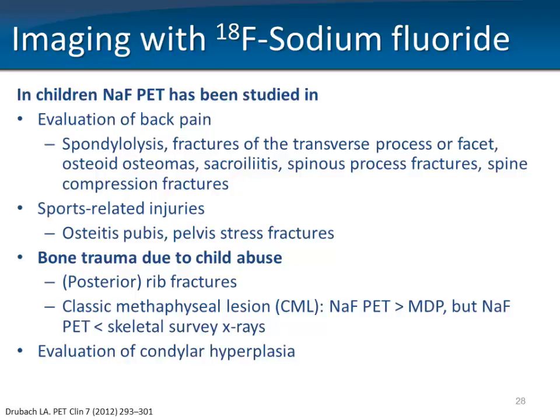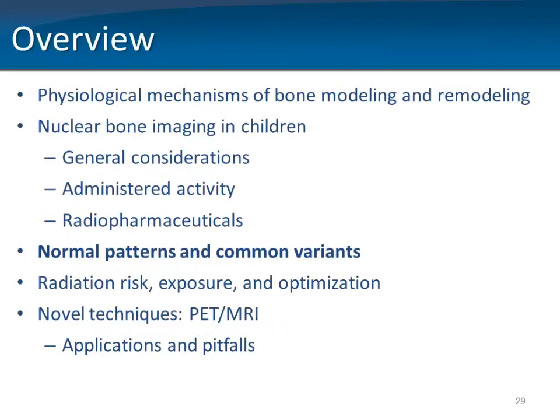However, and I highlighted it in bold, I do believe there is a very significant role for this technique if you are looking for non-accidental injury. So bone trauma due to child abuse, just because you need the additional resolution. So that is one indication where I would suggest saying that sodium fluoride PET-CT is better than MDP, even though you still have to do the skeletal surveys because it is a complementary diagnostic. But it is open for evolution, and it would be interesting to see how this slide will look in 5 years.